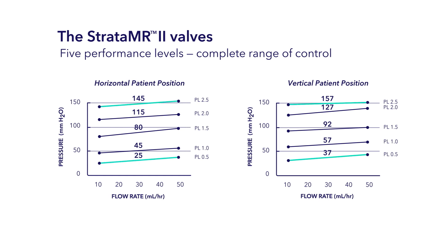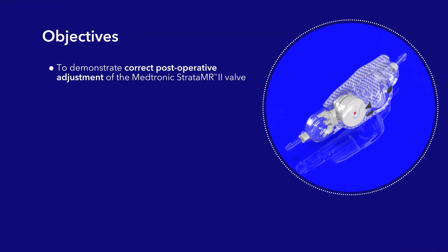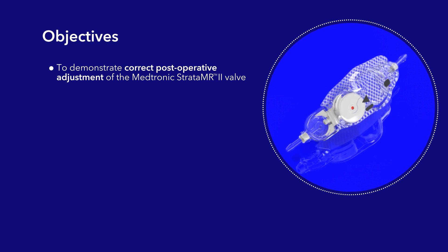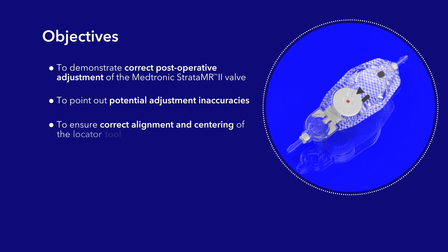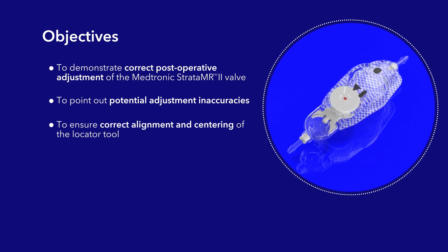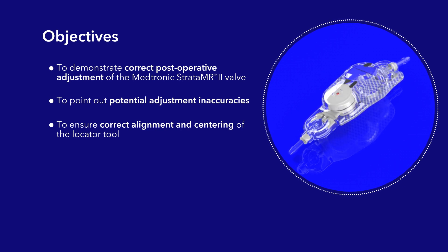The purpose of this video is to demonstrate correct post-operative adjustment of the Medtronic Strata MR2 valve, to point out potential adjustment inaccuracies, and to ensure correct alignment and centering of the locator tool. Known adjustment inaccuracies can affect the accurate reading and adjustment of the valve.